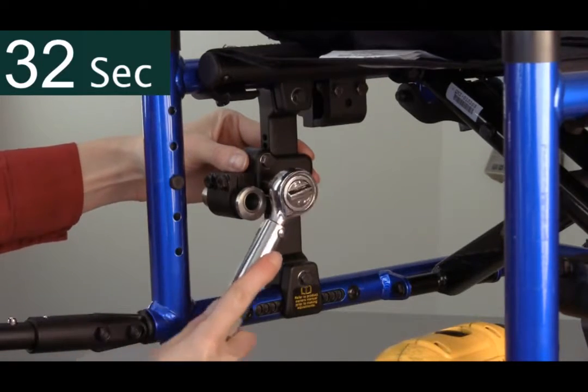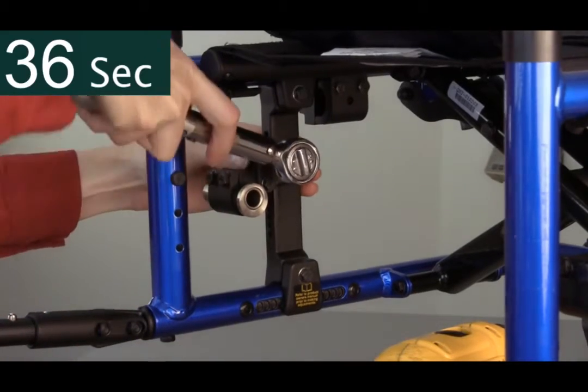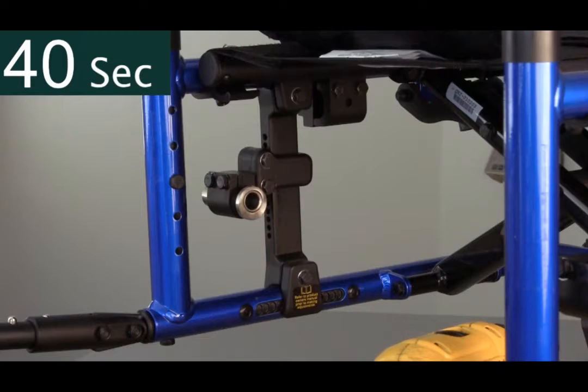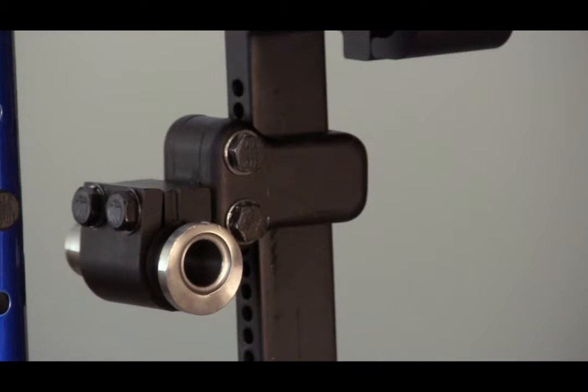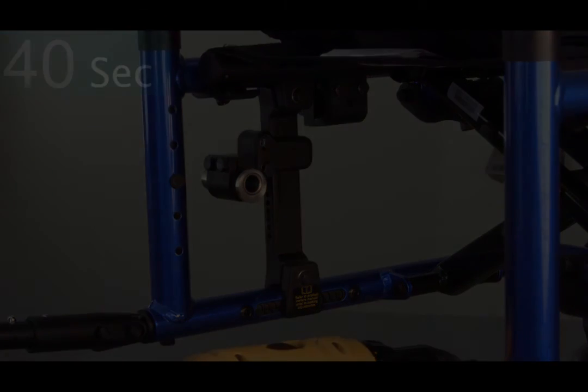It is important to always do the final tighten with a torque wrench to ensure proper tension. Consult the owner's manual for torque specifications. Again, the number of exposed index holes creates an excellent reference for the sleeve on the opposite side of the chair. Each side can be adjusted in under a minute.